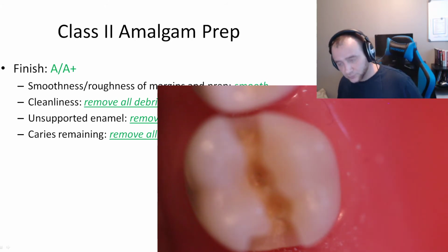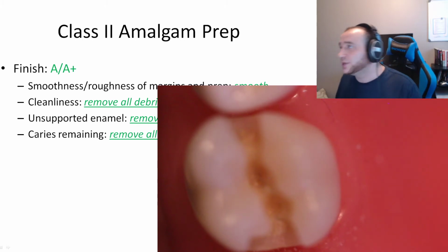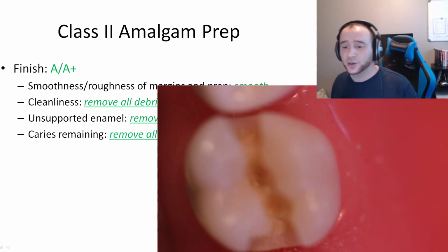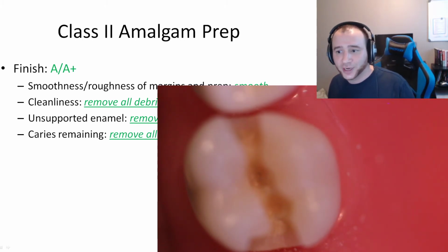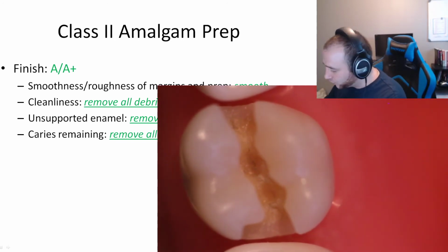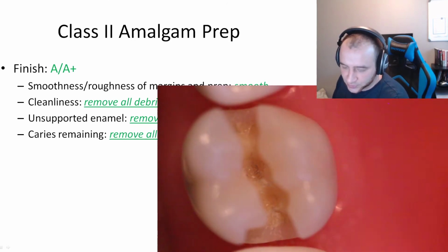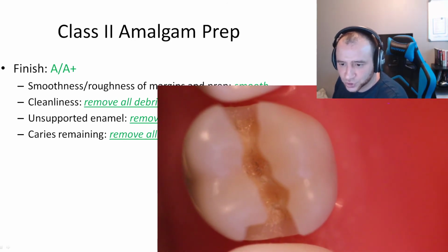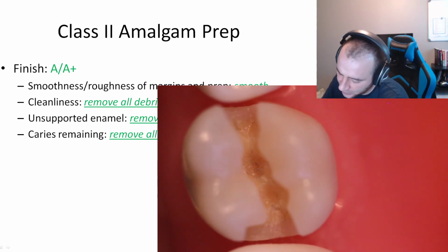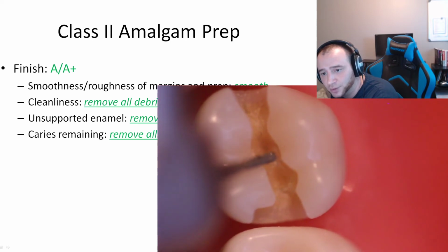So what do you do? You could leave a note. Some people leave a note that, hey, I removed the caries lesion, but that scratch is from a burr. Now, what I did to remove it is I didn't use the slow speed at the end. So you see those little dark spots or those scratches? What I would do is take my high speed with more water. So I would increase the water.